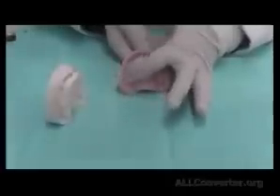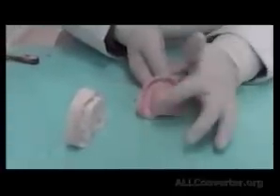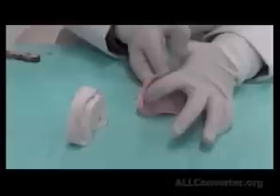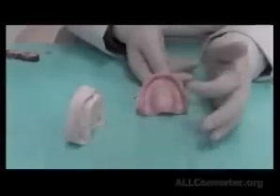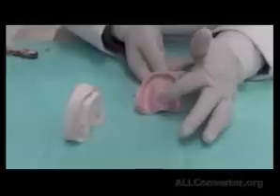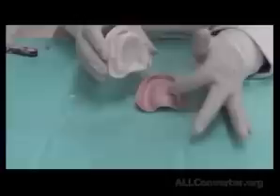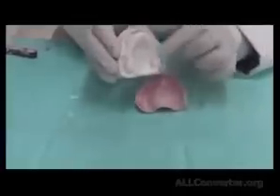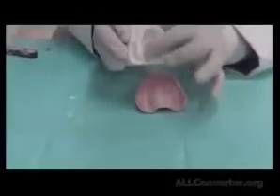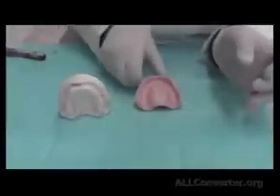If sulci are not present, if it's only on the length of the sulcus, we could add a green stick. If it's on the sulcus and some of the structures here, it's better to repeat the impression. So the cases where we have what we call high vault, patients that have a palate very deep, might also have a big bubble here. We could add impression material inside the patient's mouth on the palate before loading the tray. So that's done with people with a very high vault palate.